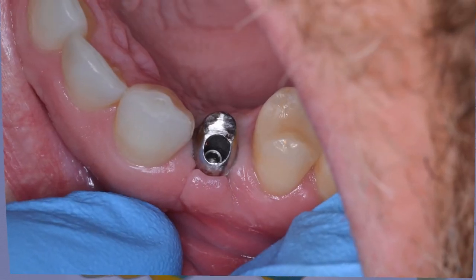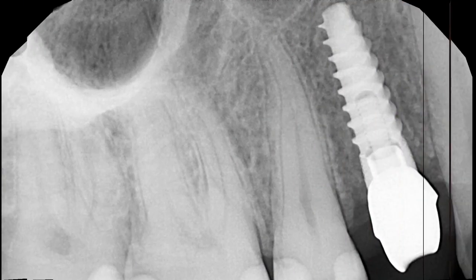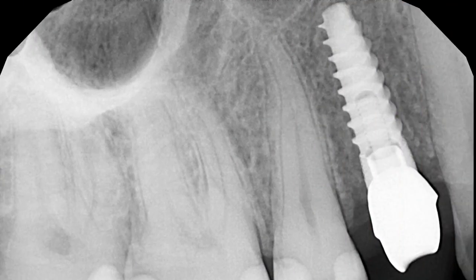You can see that the tissues around the H incision are sort of bleeding a bit. This is on purpose, and the basic purpose of this is you have the lab contour the crown so it's kind of over-contoured, so that when you cement it or put the screw-retained crown in, that forces this immature tissue that you made your H incision with to open up. And if you bring this patient back, and unfortunately I haven't seen this patient in a little while, and take another picture, this will have the most gorgeous emergence profile you've ever seen in your life.